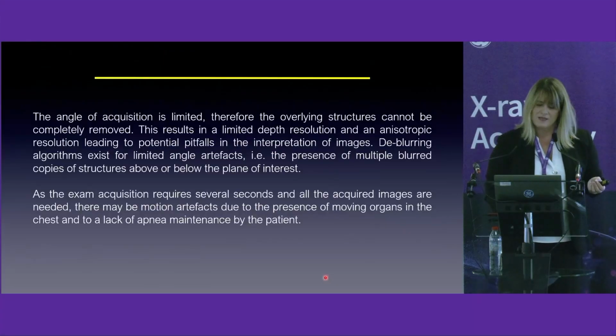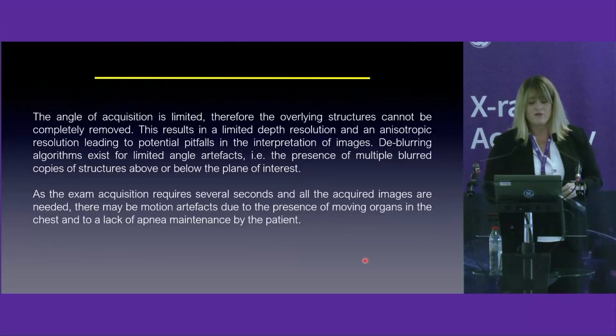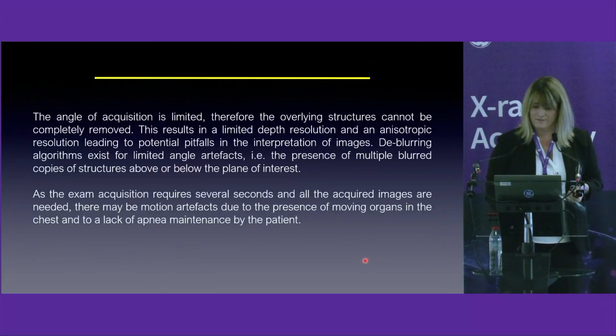However, there are some limitations. The angle of acquisition is limited. Therefore, the overlying structures cannot be completely removed. And as the exam acquisition requires several seconds and all the acquired images are needed, there may be motion artifacts.